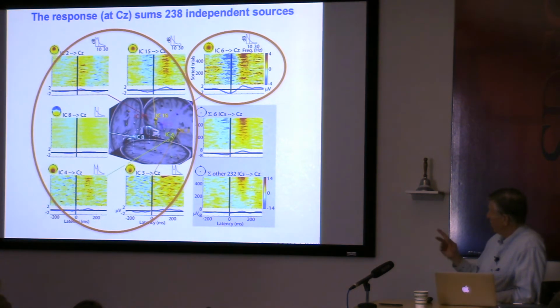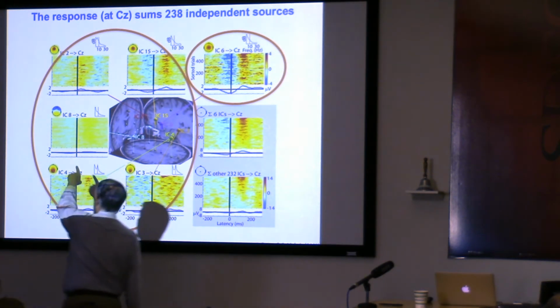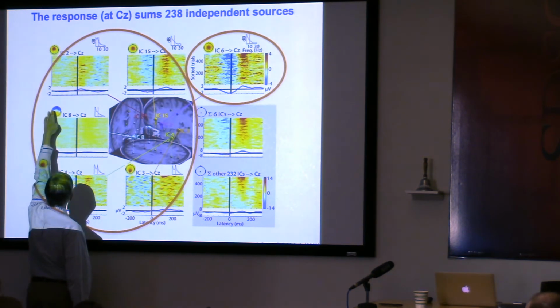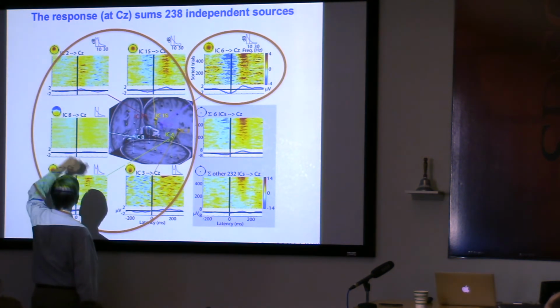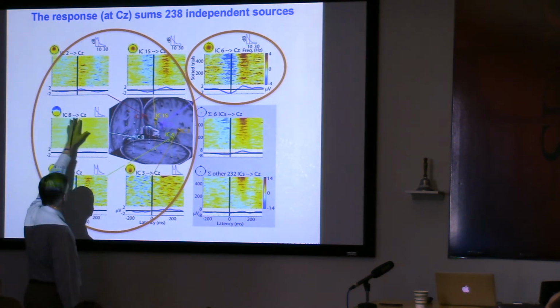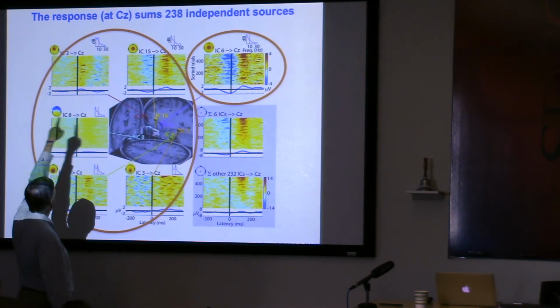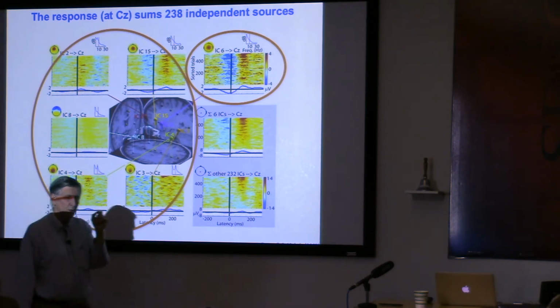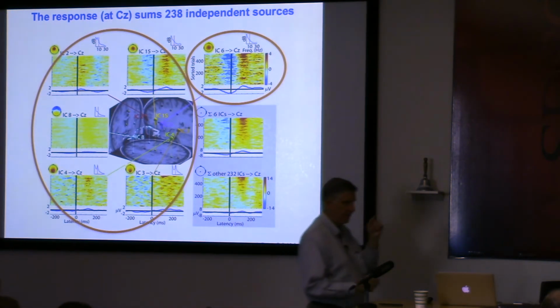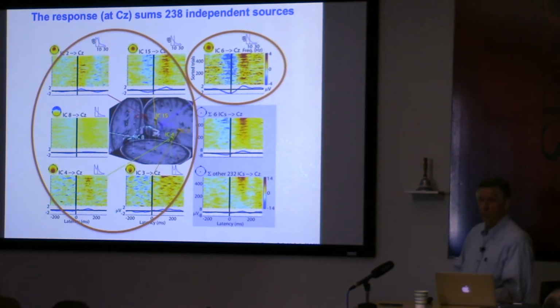They are all associated, well, except for the IC8 on the left there, which clearly has a scalp map that would be associated with eye movements, and in fact could be eye movements. I don't actually remember. But these others clearly can be fit by a single equivalent dipole. That means they can be fit by coherent activity across a single small patch of cortex. They're completely compatible with effective brain sources, in the sense I talked about.